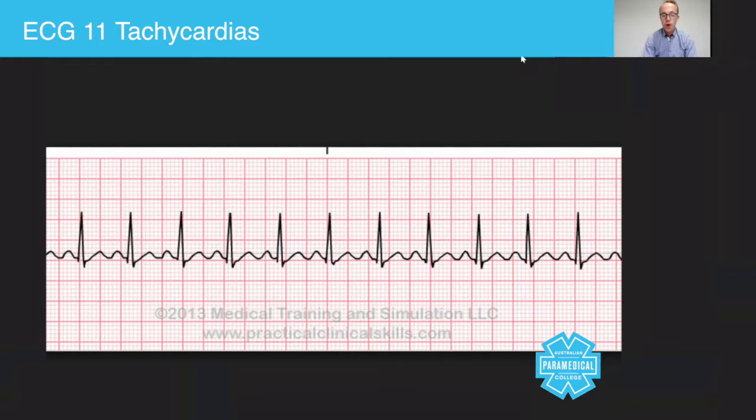Now, the three different types we're going to talk about are sinus tachycardia, supraventricular tachycardia, and ventricular tachycardia.